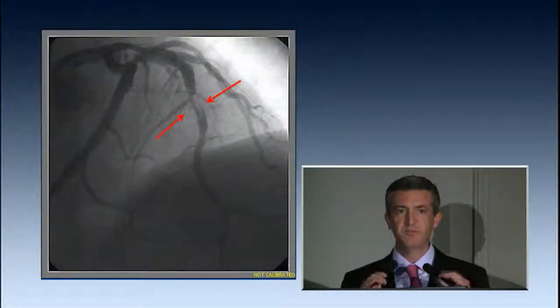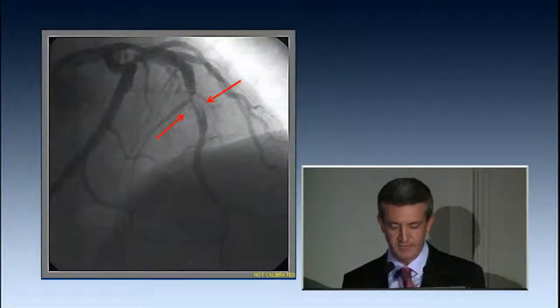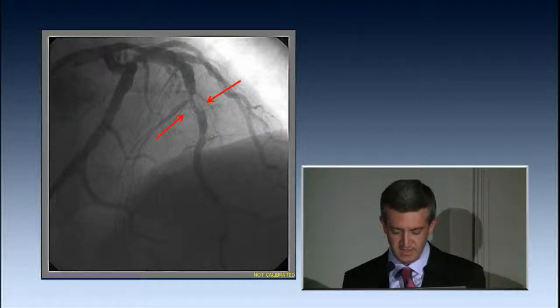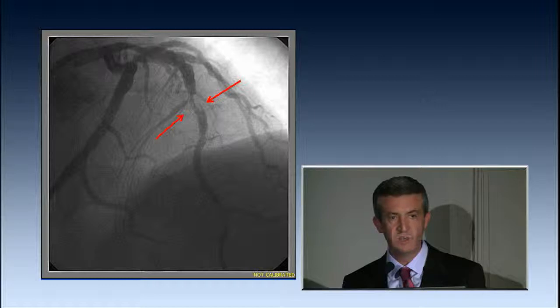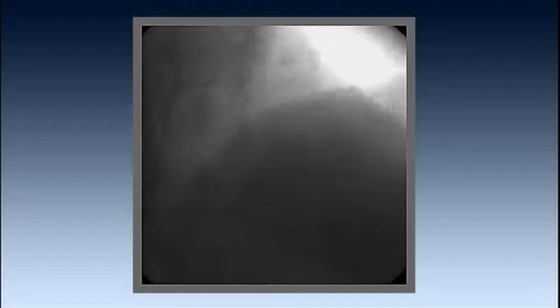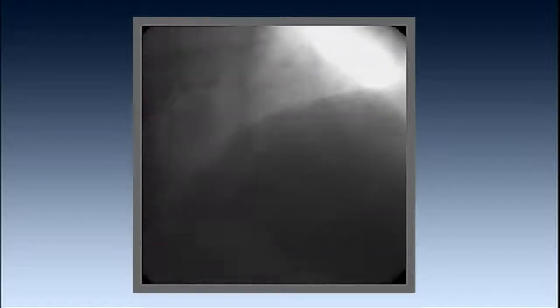Just to finish this talk, let me come up with the solution for that particular patient I started my presentation with. This patient was randomized in the MASTER trial to the MGuard. We went ahead with MGuard implantation. You see some diffuse disease, but the vessel is wide open with normal flow. This was immediately after stent implantation. That huge plaque burden disappeared, you can see it beautifully.